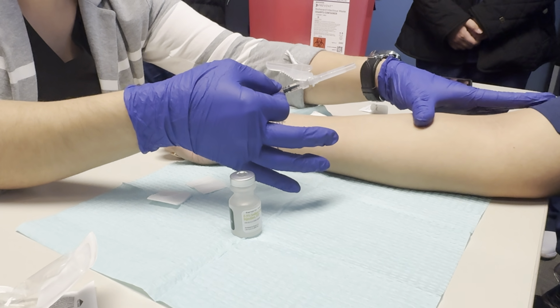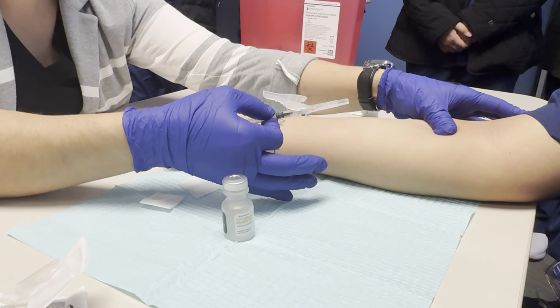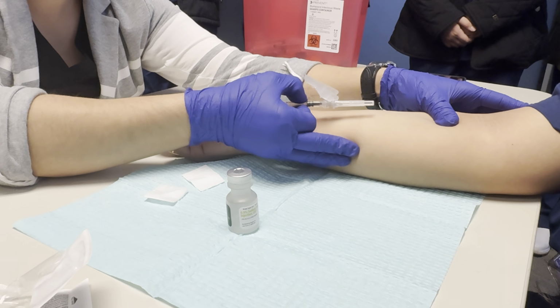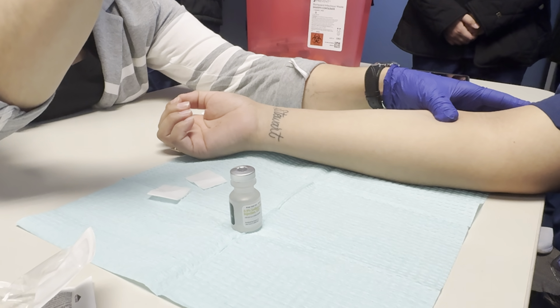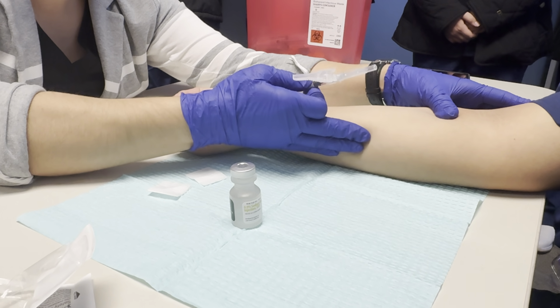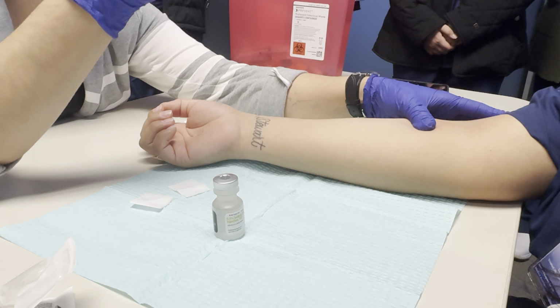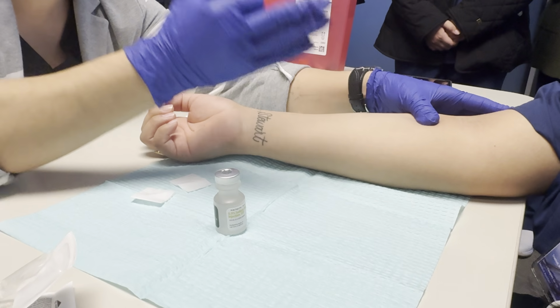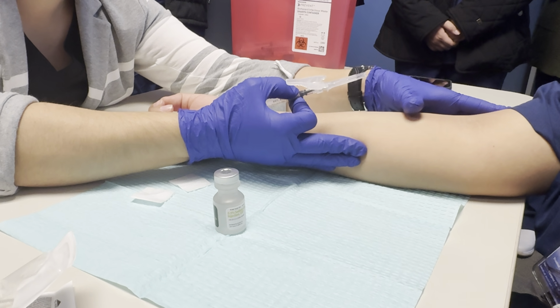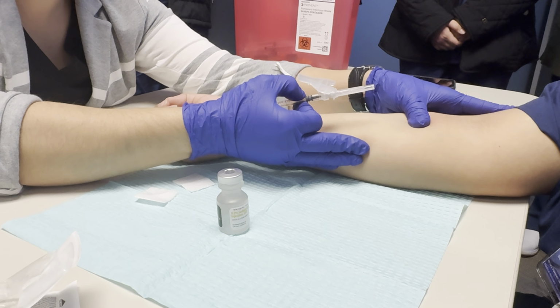What I want to do is I don't want my opposite hand to be in the way. So I'm going to anchor it from this side up. When I go to my patient's skin superficial, sometimes people's hands shake. If you get a habit of putting these 3 fingers on the side, that can give control to your hand, especially with intradermal, because in intradermal, just the tip of the needle goes inside the patient's skin, not a lot, okay? So my goal is going to be, I'm going to put 3 fingers right here, pulling your skin a little bit, which we call anchoring.